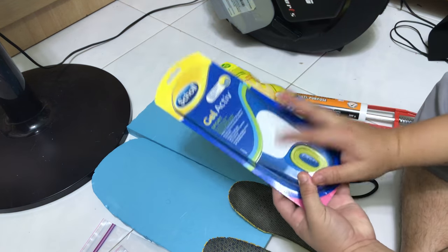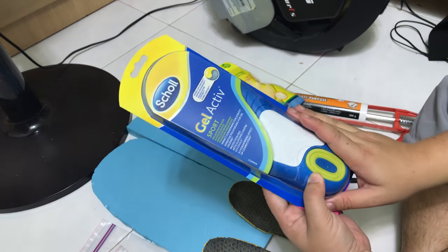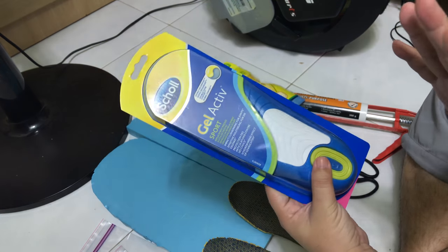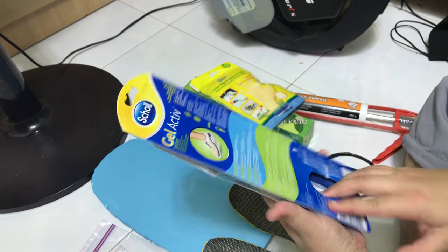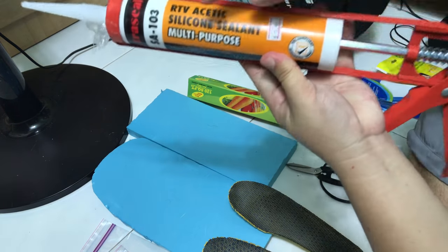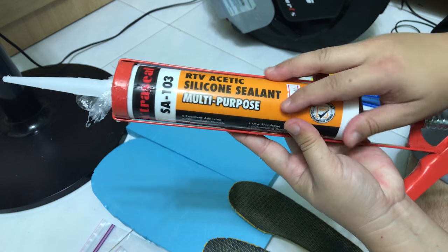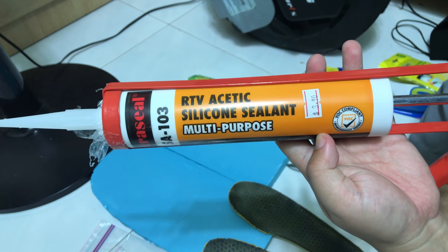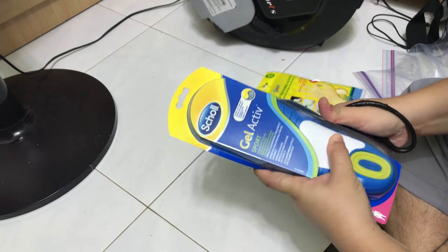Normal insoles that you buy off the shelf sometimes do have some arch support, but they are not customized to your feet and sometimes they do not offer enough for flat foot or high arches. So I'm going to show you how to make it with a multi-purpose silicone sealant that will dry up in 48 hours. Most silicone sealant does have a vinegar smell, so do take note. The first step is to take this out from the packaging.